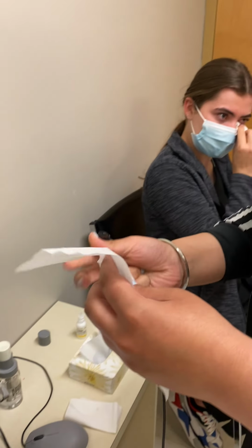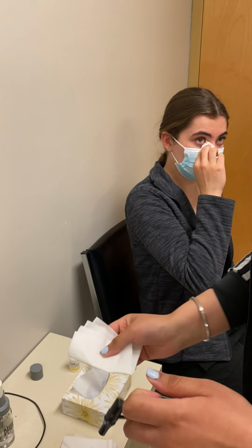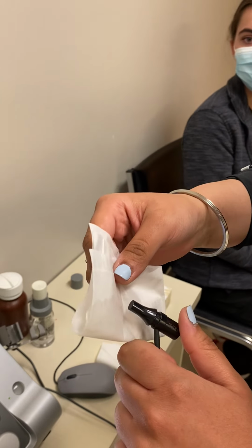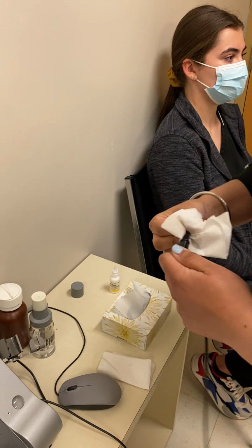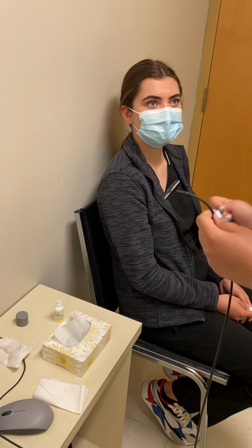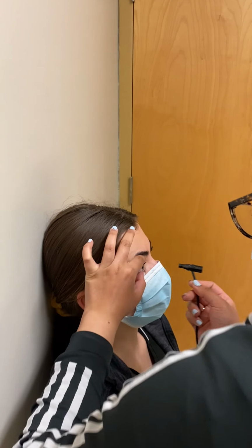So now I'm going to clean the probe. Usually after any person who uses it, they clean it, but you want to make sure you clean it before and after just to be sure. So I'm going to clean this using the alcohol that's always here. And you want to clean this part because that's the one that's going to be touching the patient's eye. And then I want to wait for a couple of seconds for it to dry. Until then, you can give the instructions to the patient. So, Robin, you're going to keep looking straight ahead at the picture of those palm trees on the wall. Keep looking straight ahead, and I'll be quick, I promise.